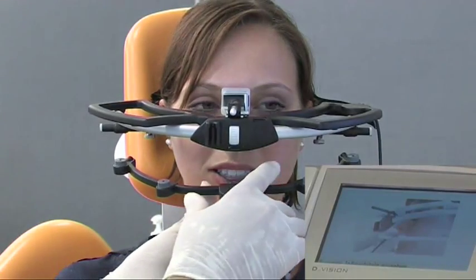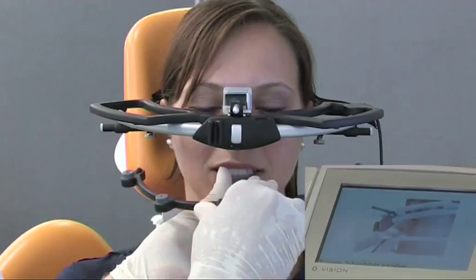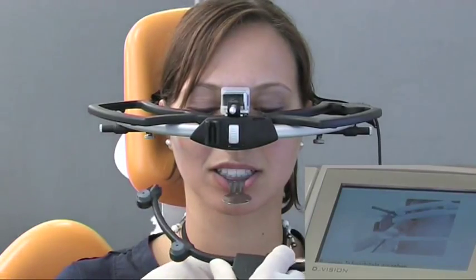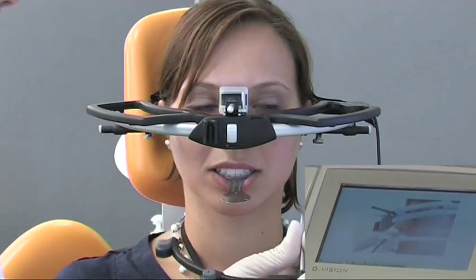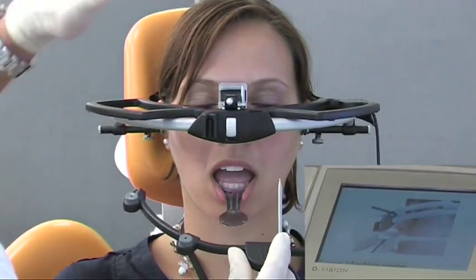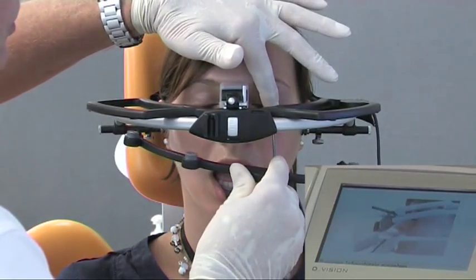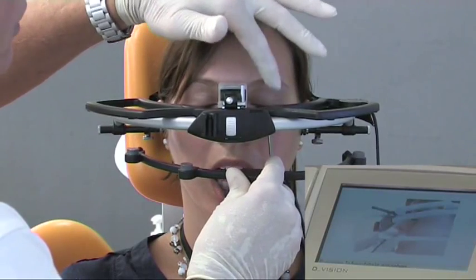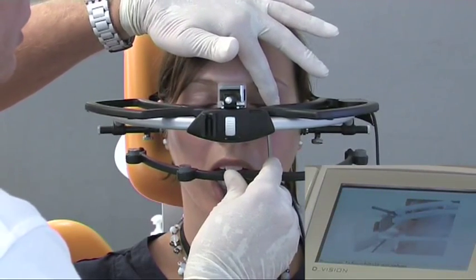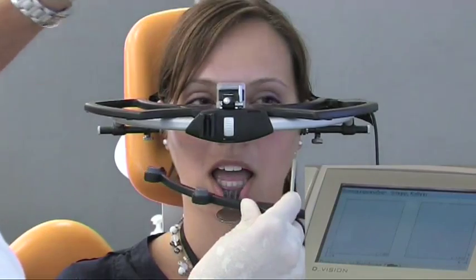At first we carry out a measurement to calibrate the system. Then the position of the infra-orbital point is measured. The measuring bow is removed and placed in the central position of the pointer. Please open your mouth and close your eyes. Use the pointer to indicate the infra-orbital point and then take the position measurement.